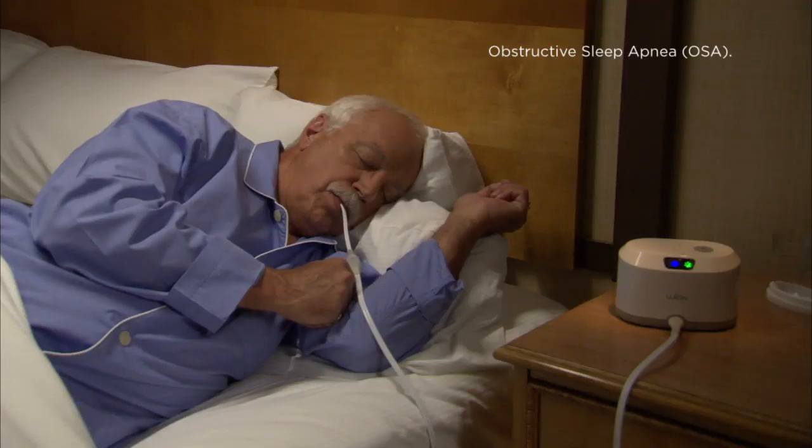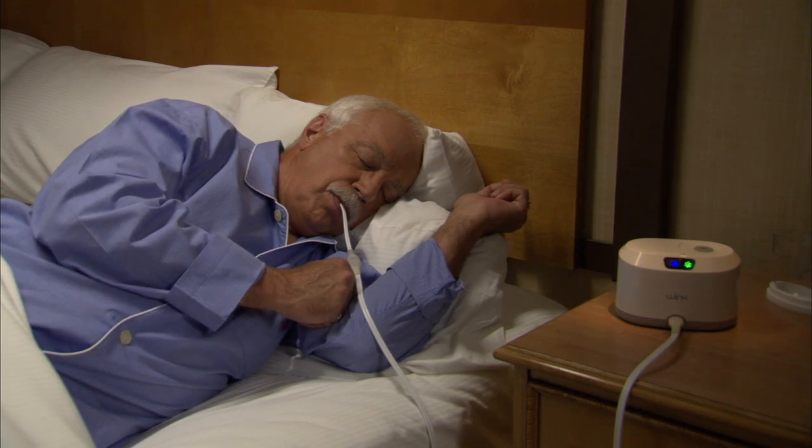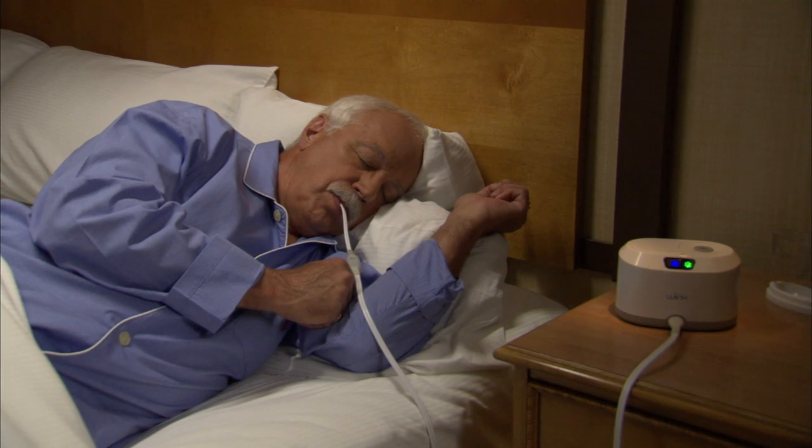The Winx Sleep Therapy System is used in the treatment of obstructive sleep apnea, also referred to as OSA. If you are an adult with mild, moderate, or severe sleep apnea, you may be a candidate for the Winx Sleep Therapy System.